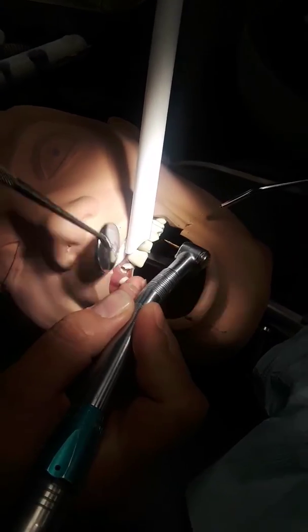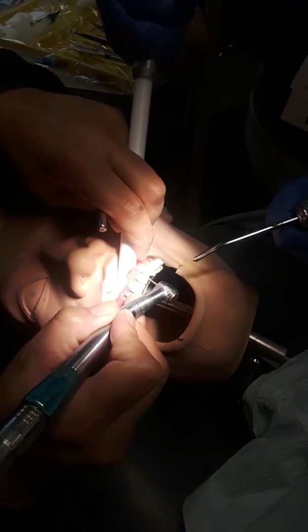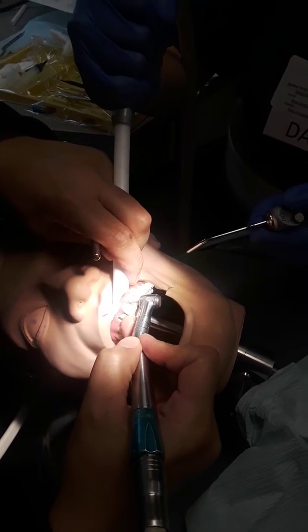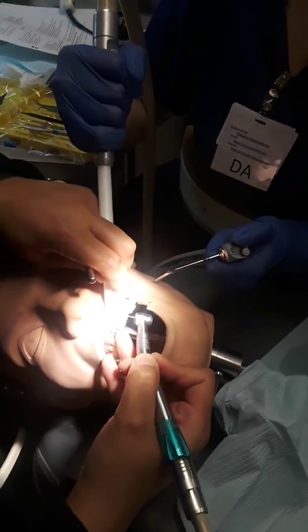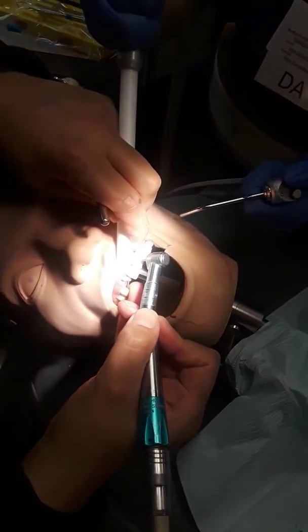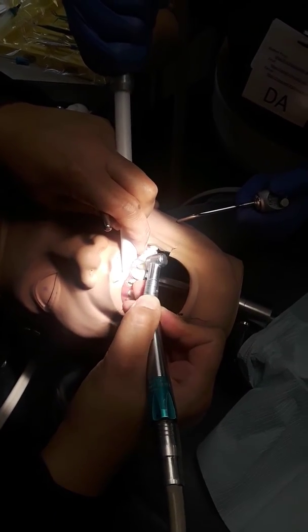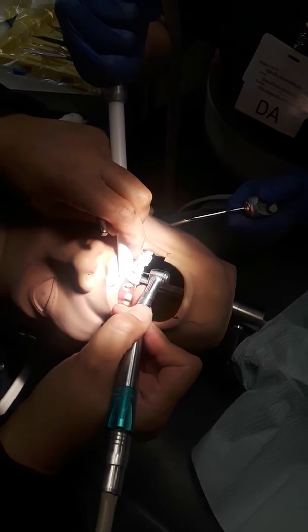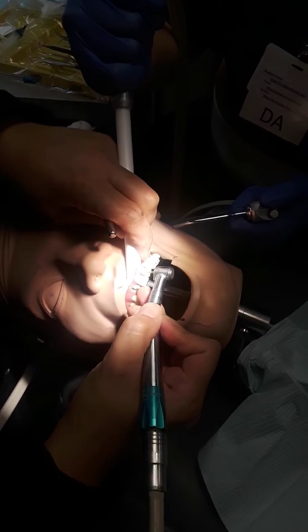While she's retracting, I need my facial surface flat or even. I can use this finishing instrument like an explorer trick — so I don't have to put it down — to feel where else I need to adjust. Just right here. I just don't rub it against the tooth.